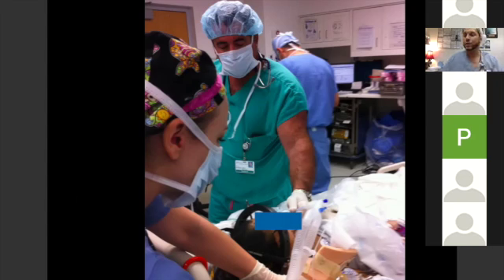So inline stabilization, and then you take that Glidescope and you slip it in the mouth and you try to just get that view without really lifting. Because the reality is Glidescope doesn't remove, it minimizes, but it doesn't remove that cervical spine motion. So you really want to just kind of get it in, get your view, and delicately put the tube in. So that would be going to sleep with inline stabilization, indirect laryngoscopy, minimizing the cervical spine translation versus an awake technique.